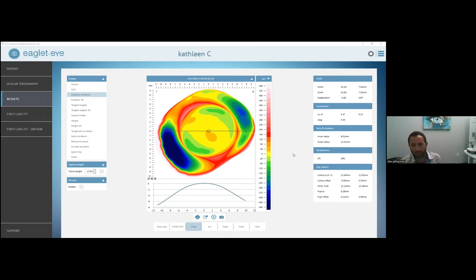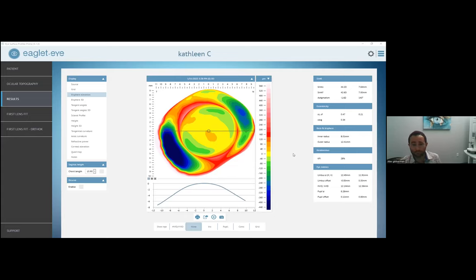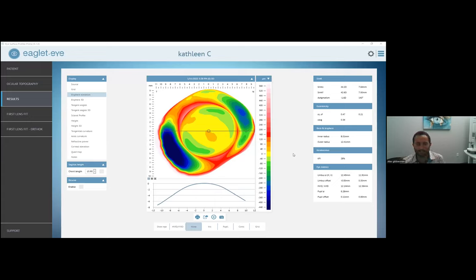Take three images per eye and select the best one. Encourage the patient to blink between images so the eye doesn't get dry. Also, if the patient is a current contact lens user — even soft or hard lenses — train your staff to ask them to be out of lenses for at least 24 hours, ideally two days. Otherwise you'll get a compression ring that will skew the data, since that indentation from the contact will show up in the image.